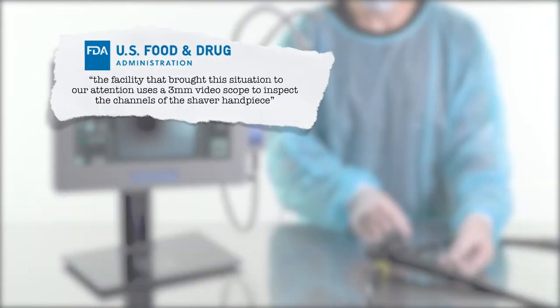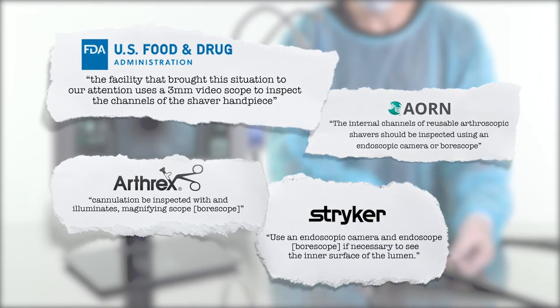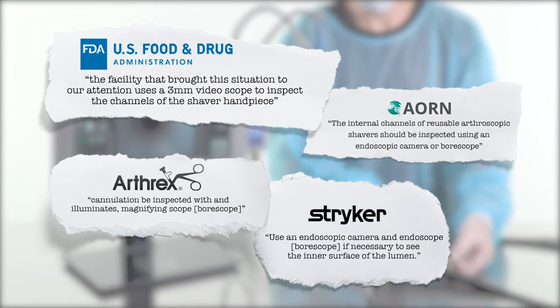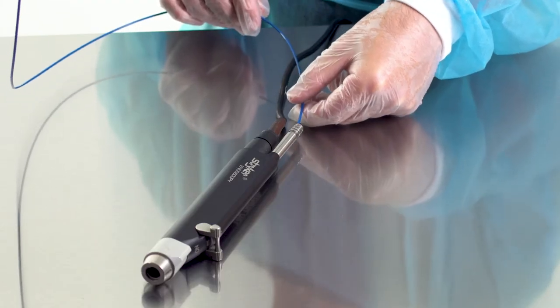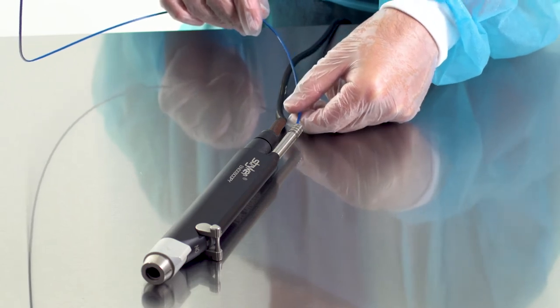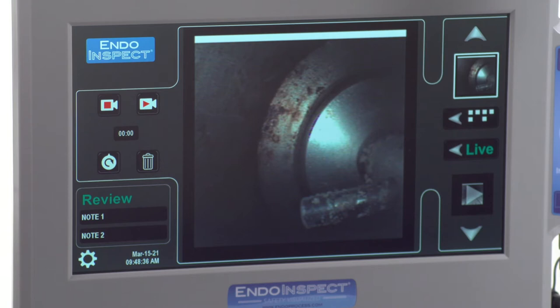National guidelines strongly recommend that sterile processing departments use a Borescope such as the EndoInspect to view inside flexible endoscopes' internal channels. National agencies and some manufacturers recommend using Borescopes like the EndoInspect to visually inspect arthroscopic shavers after cleaning to ensure they are clear of any tissue or fluids.